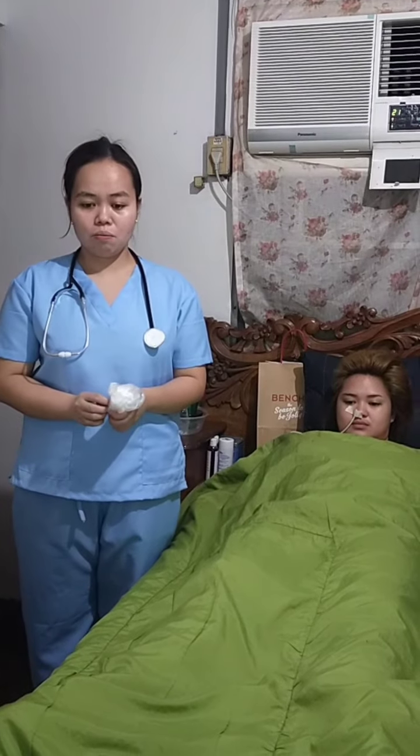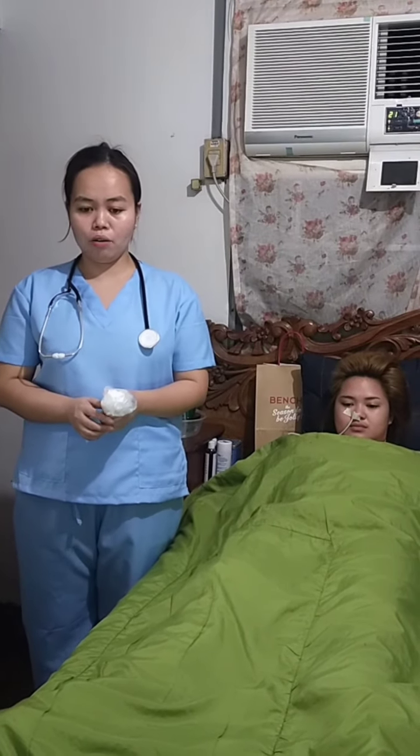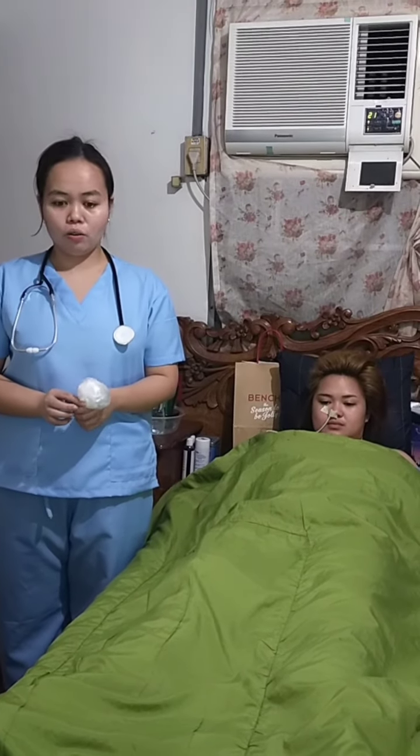Now we're going to remove and dispose of the gloves and perform hand hygiene to prevent the spread of microorganisms. Then properly replace the used equipment to prepare for the next procedure. Record the date, the time, the size of the nasogastric tube, the amount and color of drainage aspirated, and the client's reaction. Then sign the chart and report to senior staff to provide continuity of care.